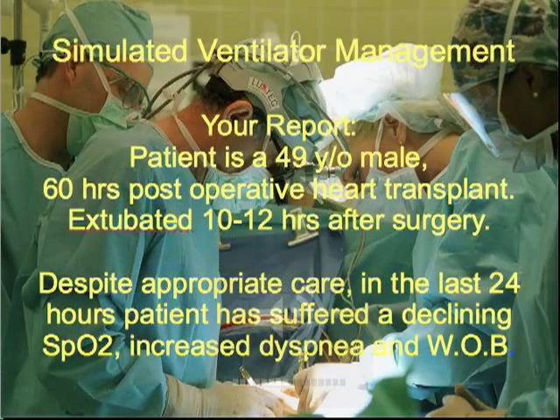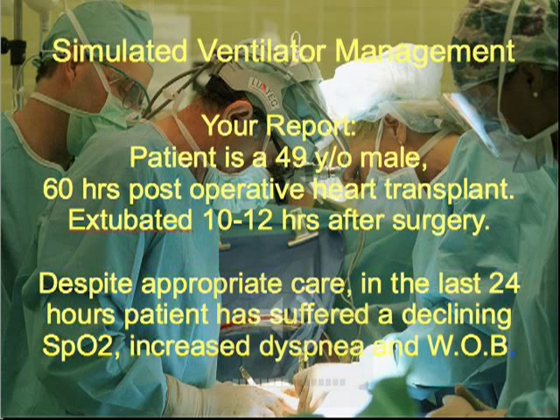Time for a new case and I'll set it up for you. This is a 49 year old male, 60 hours post-operative heart transplant. He was extubated only 10 to 12 hours after his surgery.